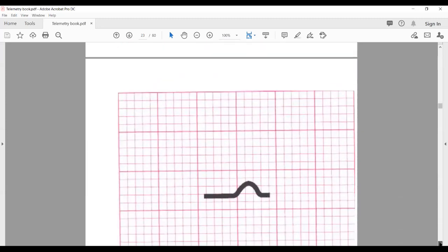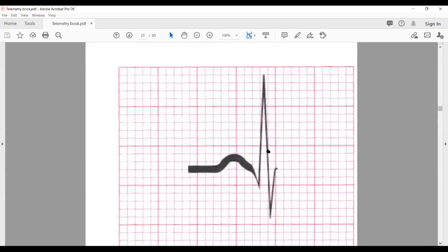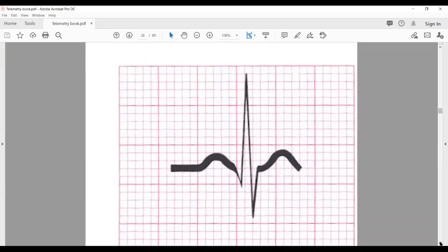And now the depolarization, the P wave, is going to start propagating. So the SA node is going to send its signal to the AV node. So if this is P, then this is our Q, or our AV node. And then they're going to the bundle of His, which is going to propagate to the right and left ventricles of the heart throughout the bundle branches to the S. And then when we get to the S, which is our bundle branches, the bundle branches are going to propagate to the Purkinje fibers, which we see here. So we have propagation to the Purkinje fibers, and the heart is going to repolarize, and the heart is going to rest.